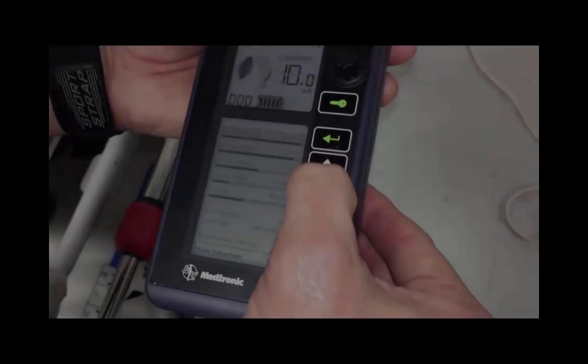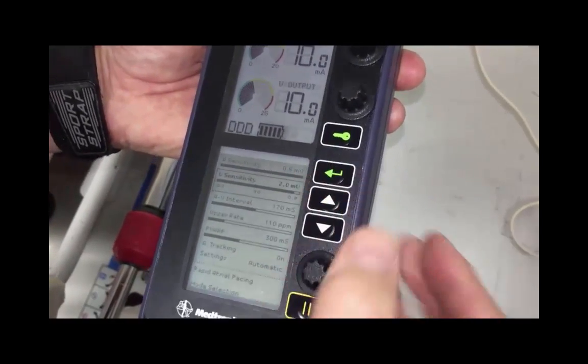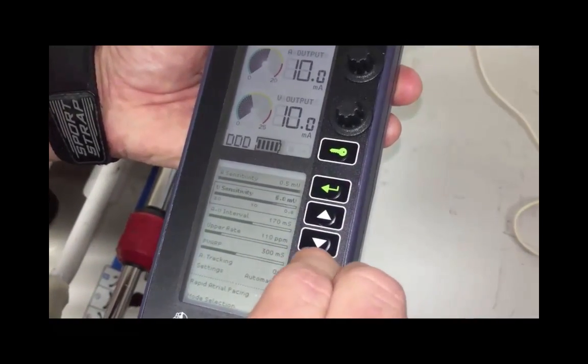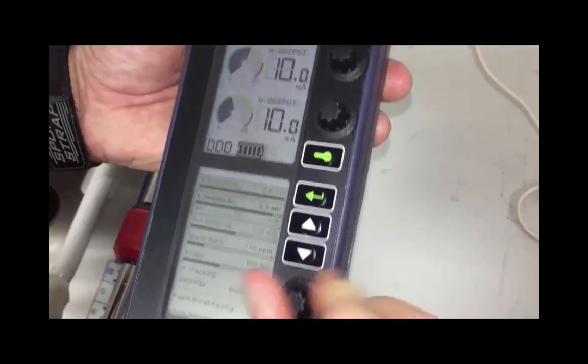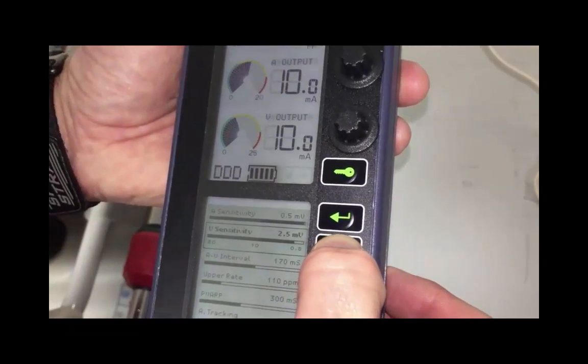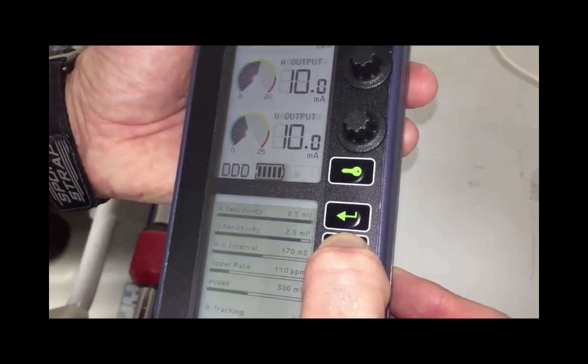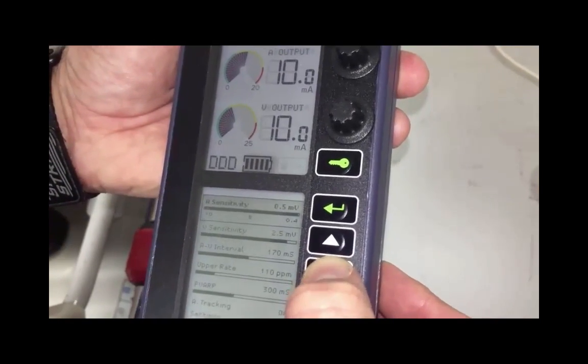As previously discussed, there may be a time where you will need to adjust either the atrial or ventricular sensitivity. That is easily done in the lower screen menu by selecting either the A or V sensitivity and then using the dial to adjust. Remember that when you are increasing the sensitivity, the millivolts goes down. When you are decreasing the sensitivity, the millivolts go up.